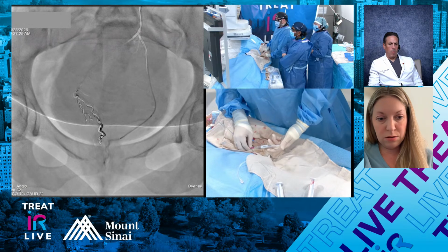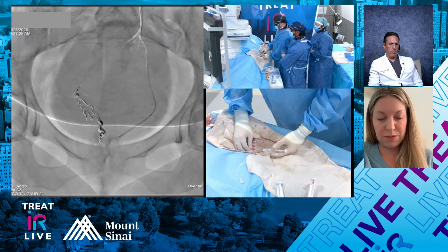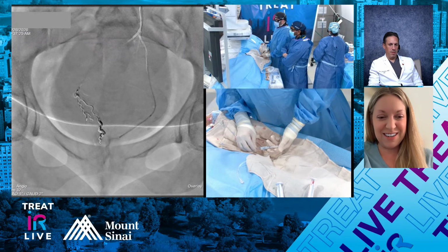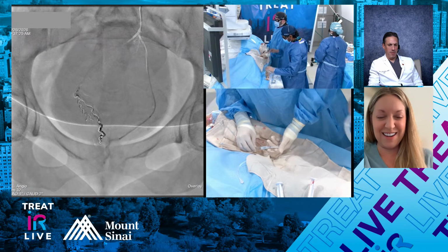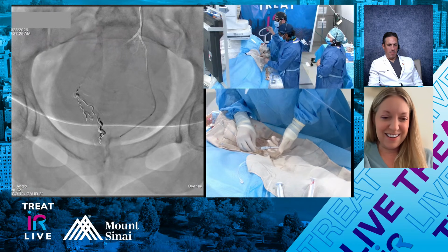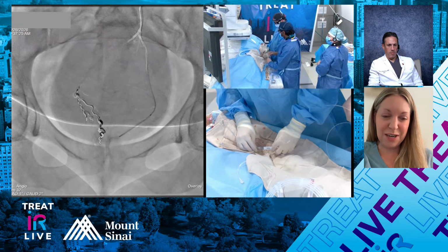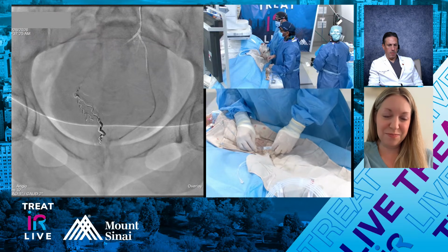Do you see that wire technique? That's impressive. I mean, I learned it from Jay just 3 minutes ago. I do the 3 months as well, Jesse, where no decisions are made about any other treatments for 3 months. Let's see where the dust settles here.